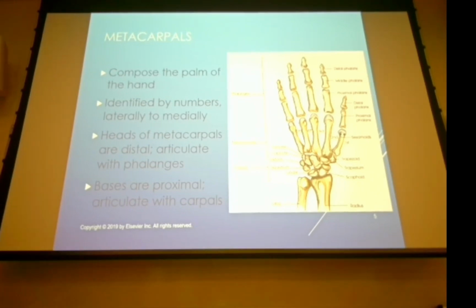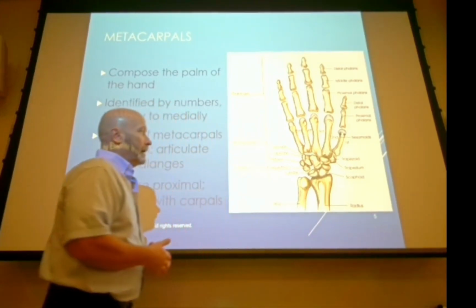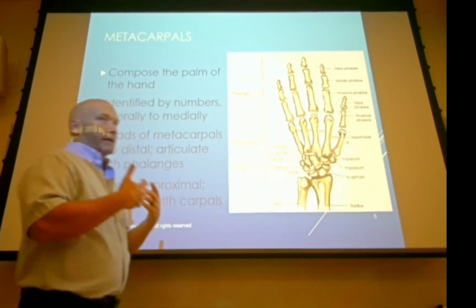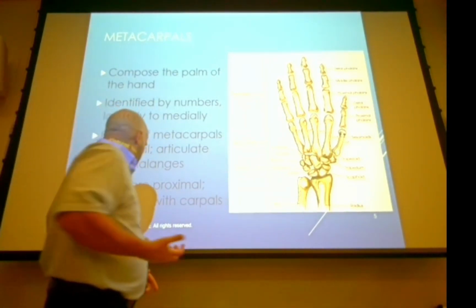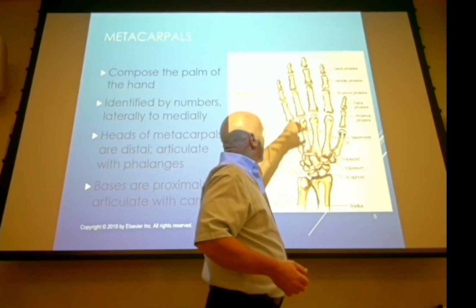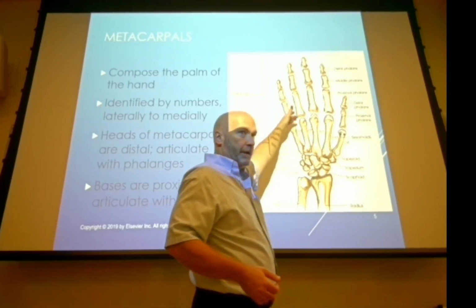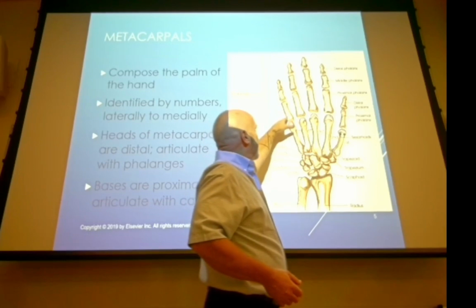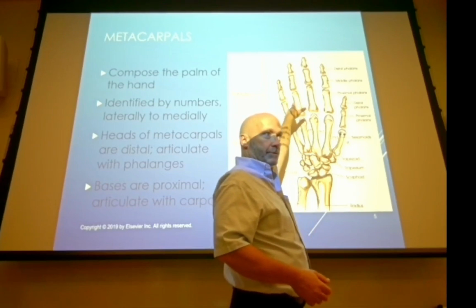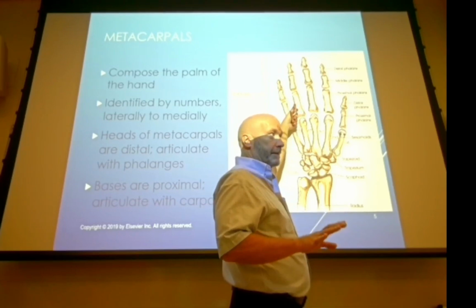Articulation. Okay. So when we're trying to identify where to put our central ray, which number is this? 3rd. Right. So we've got articulations there as well. We should have a laser pointer, but what we have here is a metacarpal, and that's a phalanx, right? So this would be the 5th metacarpophalangeal joint. That's a phalanx, and that's a phalanx, which means that's going to be an interphalangeal joint. But which one is it? It's 5th. Right, still the 5th.